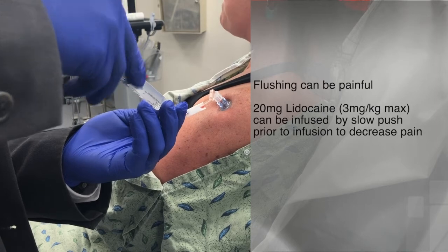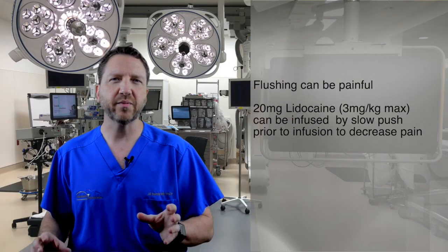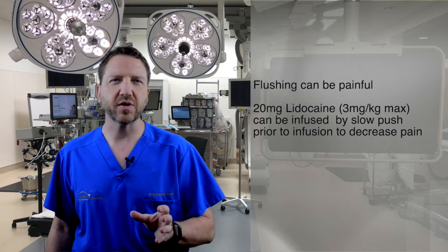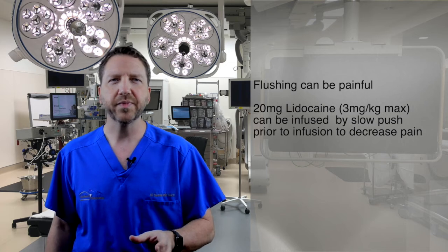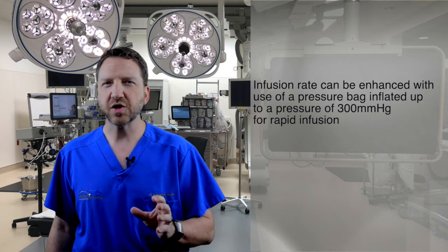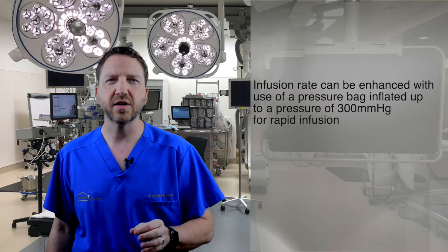Flushing can be a source of significant pain in the awake patient, and 20 milligrams of lidocaine, or a maximum of 3 milligrams per kilogram, can be infused by slow push to help reduce this pain prior to infusion. At this point, start infusing using a pressure system. Pressure bags at 300 millimeters of mercury can be used to aid in rapid infusion.